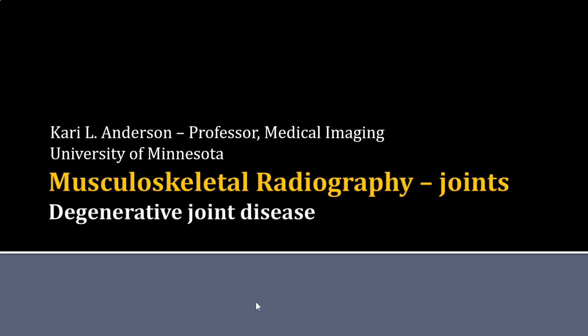This is the first in a series of presentations on the topic of disorders affecting the joints in veterinary patients. Be sure you keep reviewing the normal structures and normal appearance of bones as you continue to identify alterations in the normal radiographic signs as we continue through our topics.